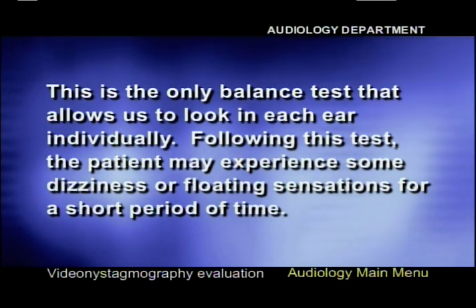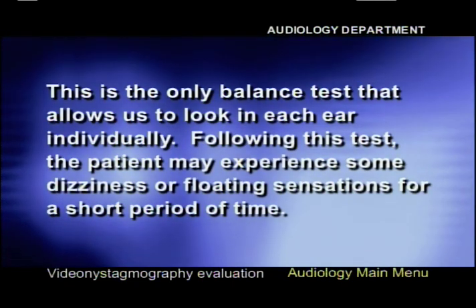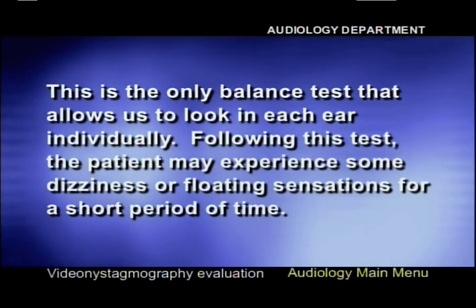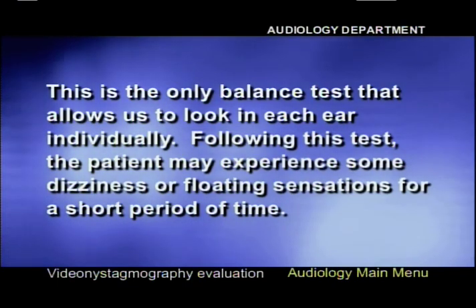Following this test, the patient may experience some dizziness or floating sensations for a short period of time.